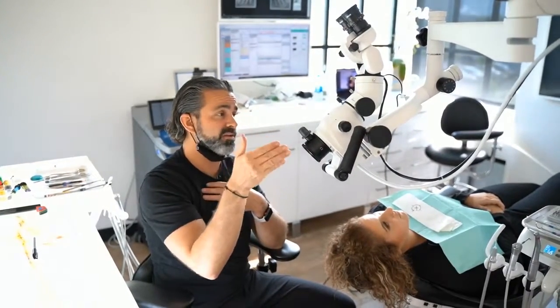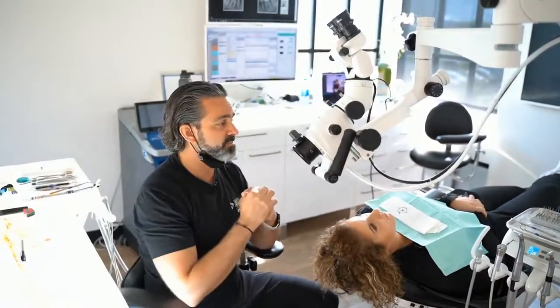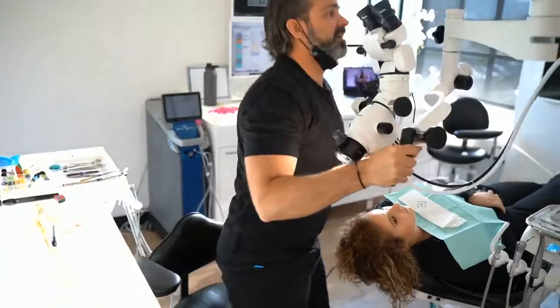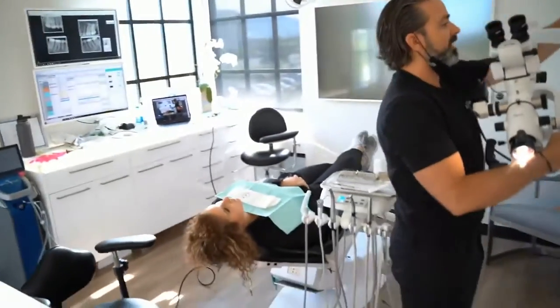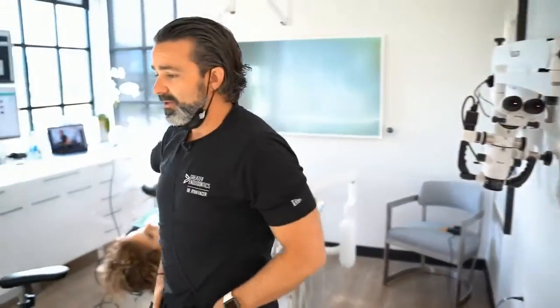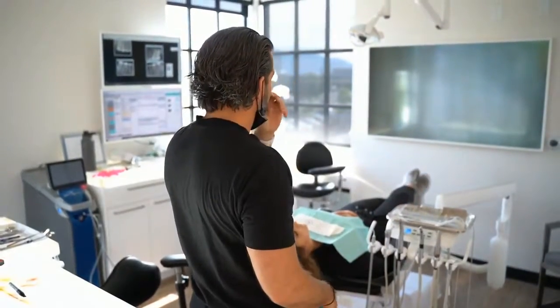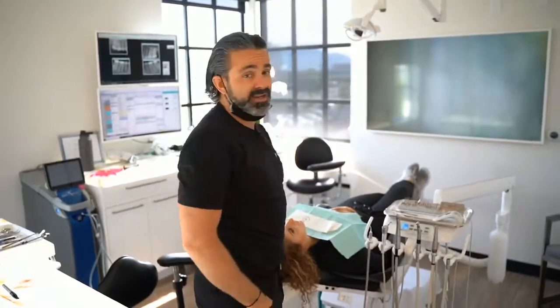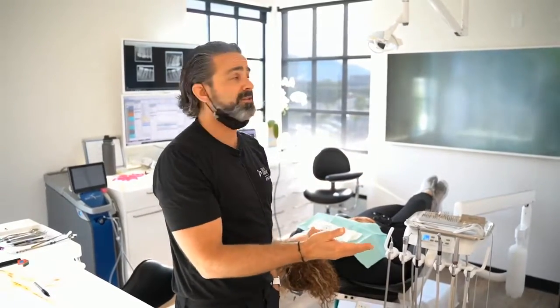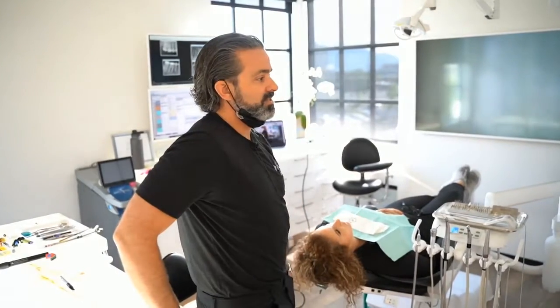People thought that it would interfere with patient flow. I can enter my room from both right or left sides, but where I have my guest chair sitting, like I said, this microscope tucks up on this wall. I wanted it to fit the look and feel of my office, so that was a big selling point. And I just didn't want to look at anything, even an overhead light. I don't really use that overhead light, since I use my microscope light for everything, but we still put them in because we have 4 doctors, so some guys still use that.